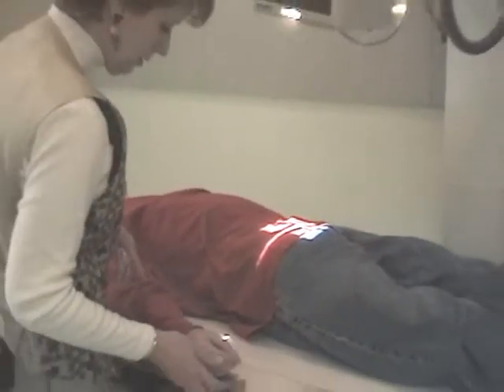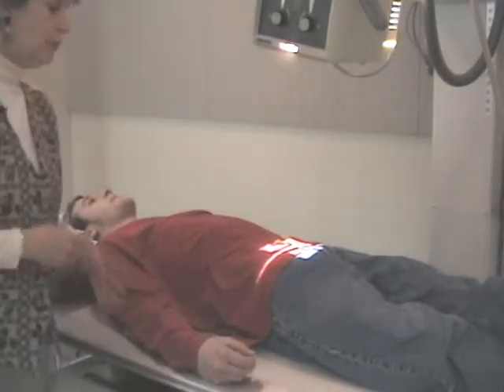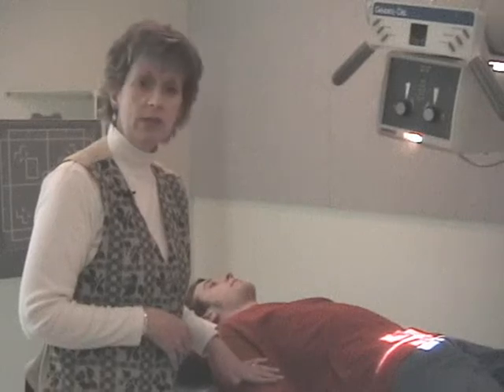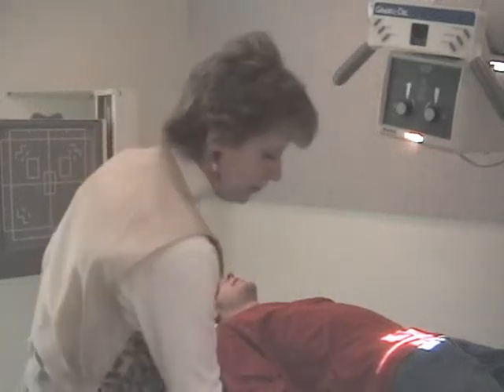If I had a scrotal cup, I would be able to protect his gonads. I don't in this demonstration today. So we're going to make the exposure. Just have your patient take in a breath and blow it out, and you can make the exposure. Have your patient remain in the same position after you make your exposure. Let them breathe. Their body is straight, MSP's to the center of the film.